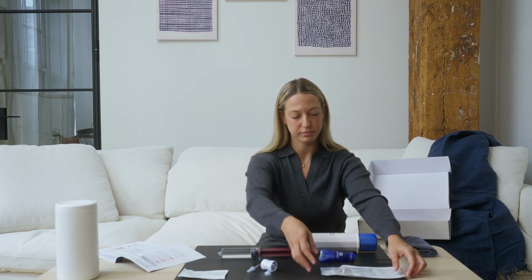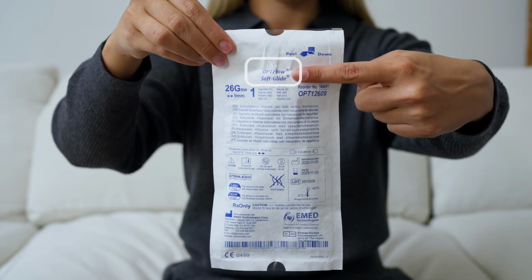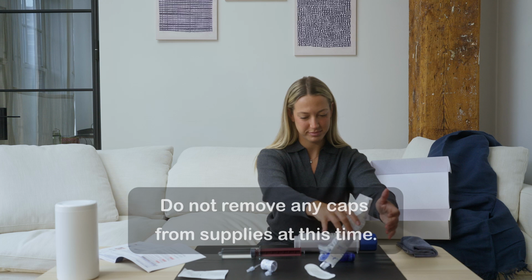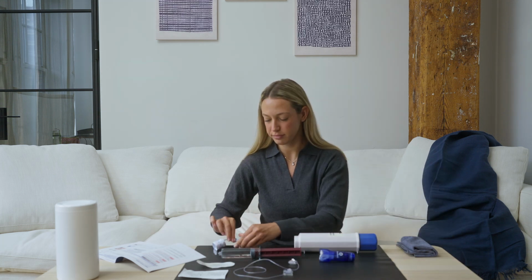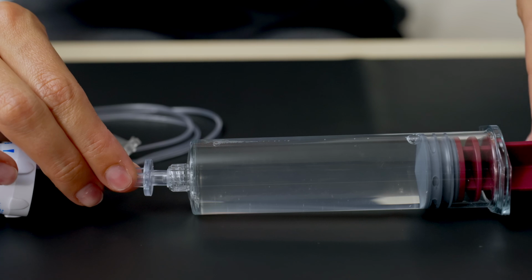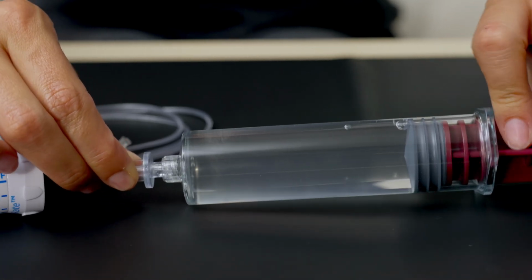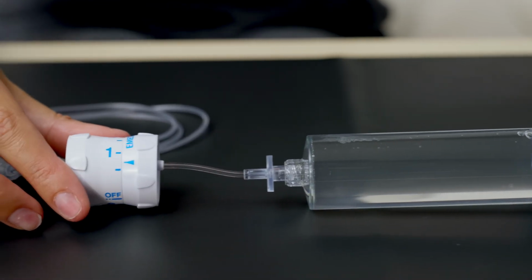Remove all supplies including the InfuSet or flow controller, OptiFlow needle set, and syringe from the sterile packaging using aseptic technique. Do not remove any caps from the supplies at this time. You will now remove the sterile luer lock caps from the InfuSet or VersaRate flow rate controller using aseptic technique. You will then connect the syringe male luer lock to the InfuSet or VersaRate female luer lock using a twisting motion while making sure not to over-tighten.